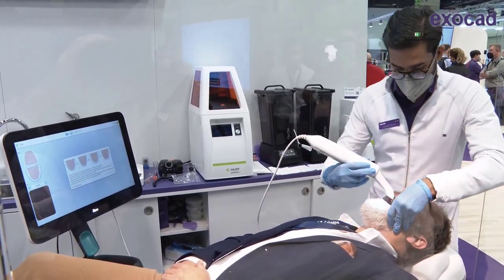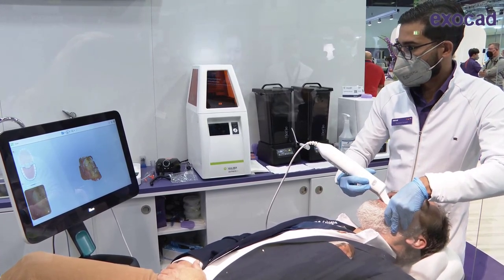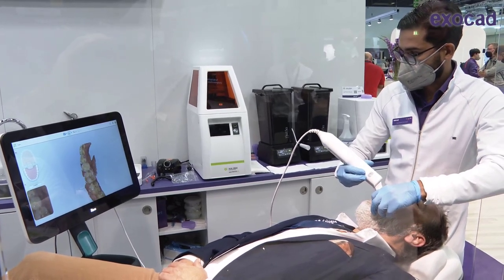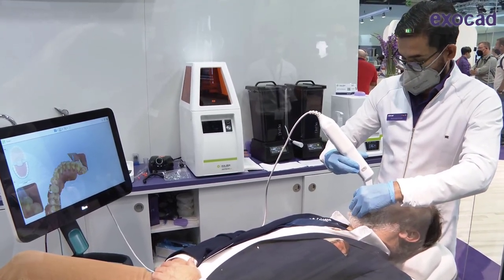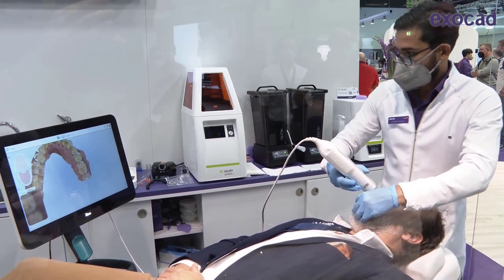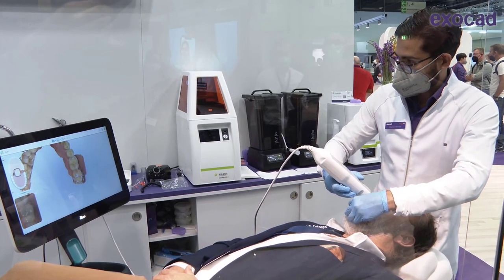Now we go to the lower arch. What we'll need is a reference scan for our contacts and a bite scan. You can see there is a bit of saliva there — not an issue at all. You'll just scan over it and the system will remove it. Best practice is to use a bit of compressed air in some cases, but in most cases all you need to do is swallow before the scan and off you go.